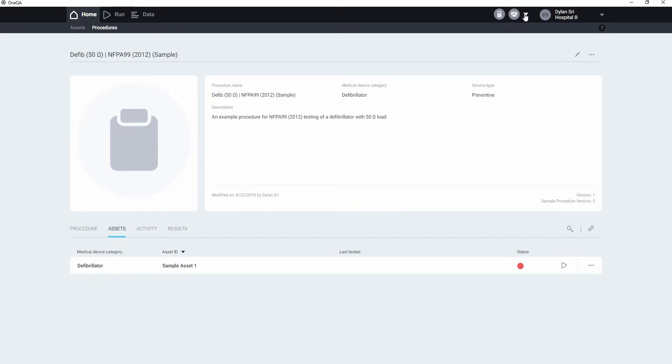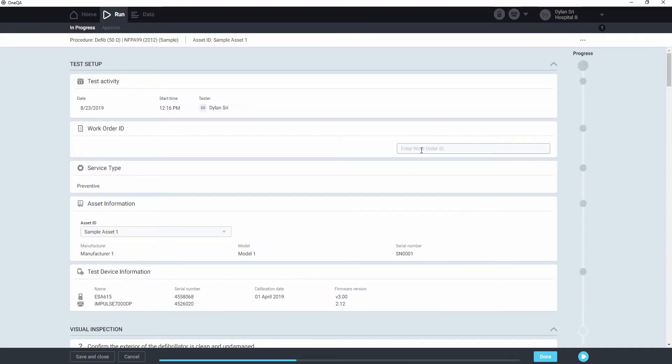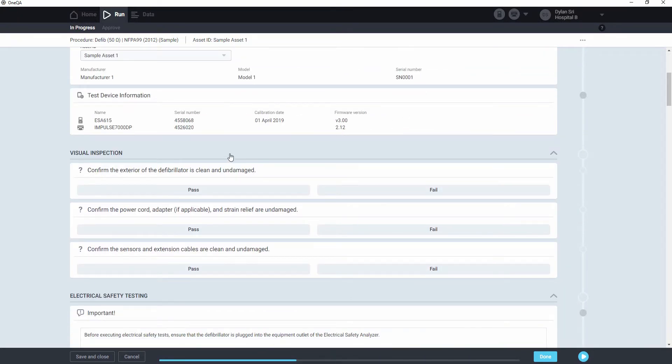We'll launch that, and we already have our test devices connected. We'll enter our work order ID, and then do a visual inspection. Take a look at the defibrillator, make sure it's clean and undamaged, etc.